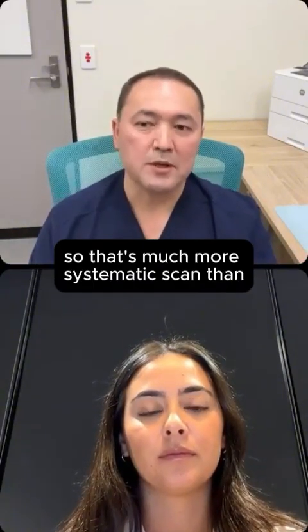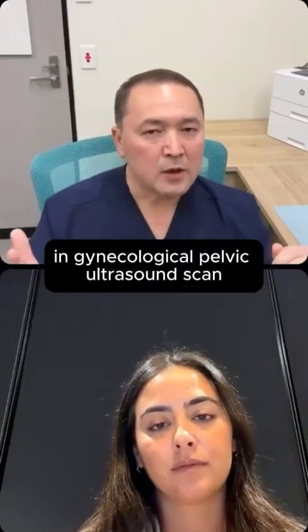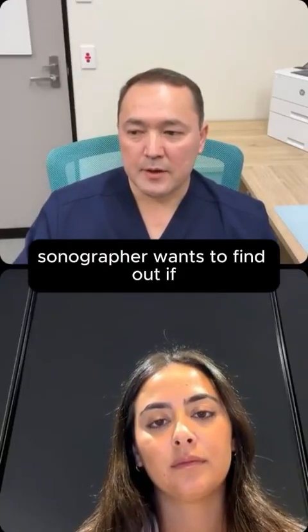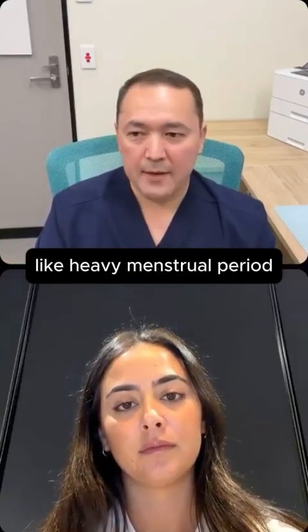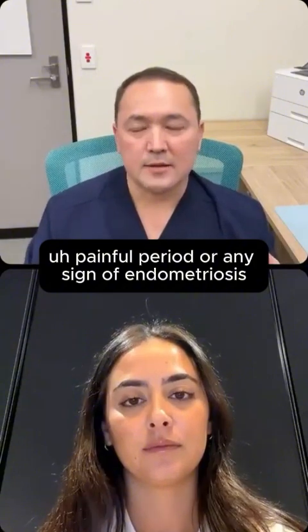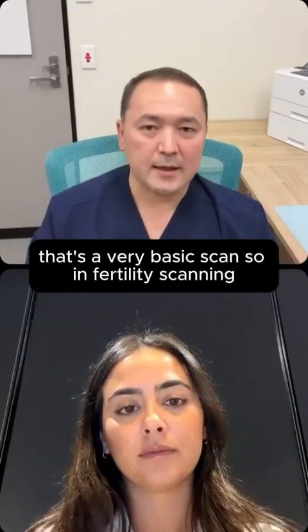That's a much more systematic scan than a gynecological scan. In a gynecological pelvic ultrasound scan, essentially the sonographer wants to find the cause of gynecological problems like heavy menstrual periods, painful periods, or any sign of endometriosis or ovarian cyst. That's a very basic scan.